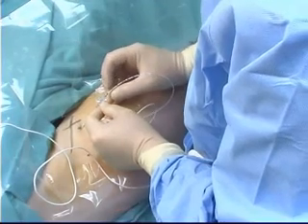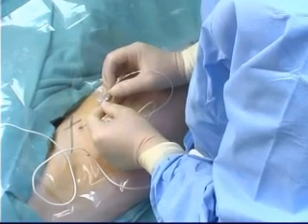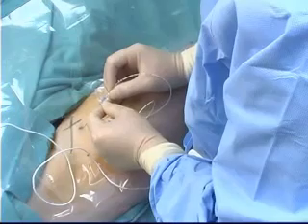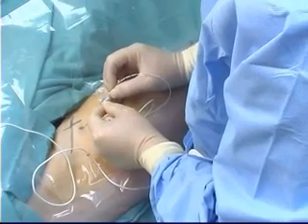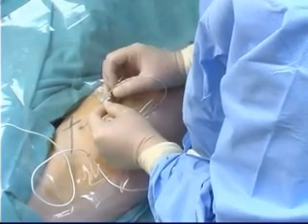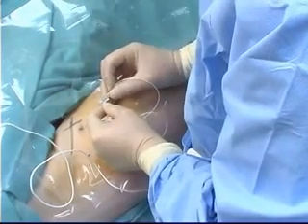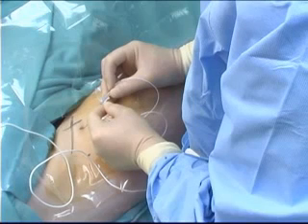In the case of this demonstration, the muscle twitches continue at a nerve stimulator output of 0.42 milliamps during catheter advancement. This indicates that the catheter is following the nerve, and this assures correct catheter placement. If, however, the twitches disappear, carefully withdraw the catheter to inside the needle shaft again, such that the entire broad black mark is visible again.